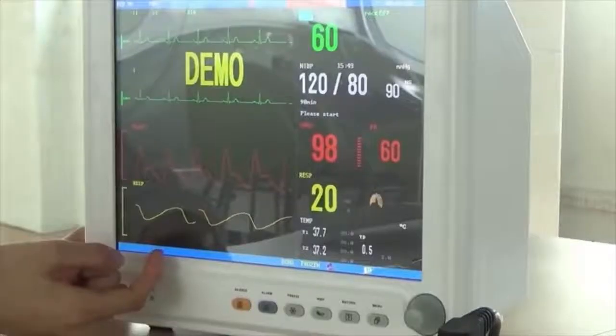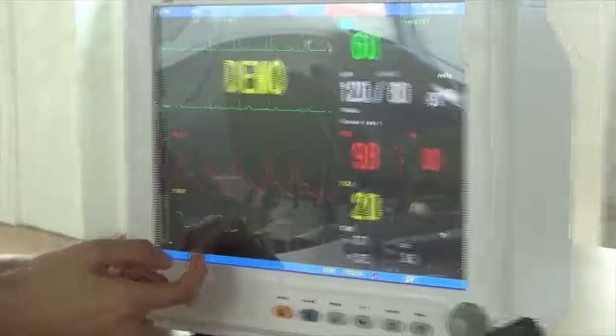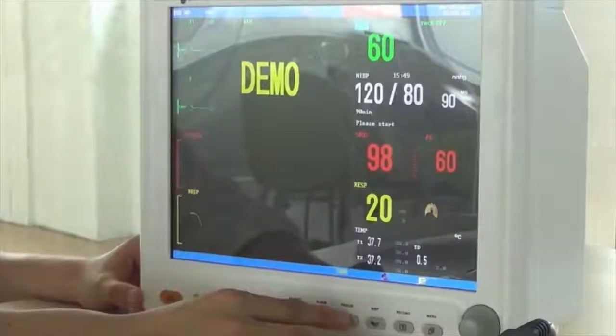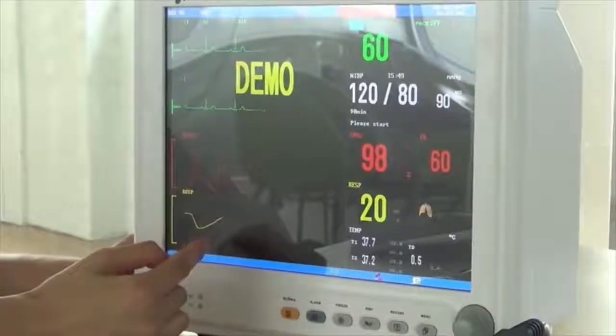R.E.S.P. The waveform is still — it is used for better observation. Press again, and it will return to the normal state.